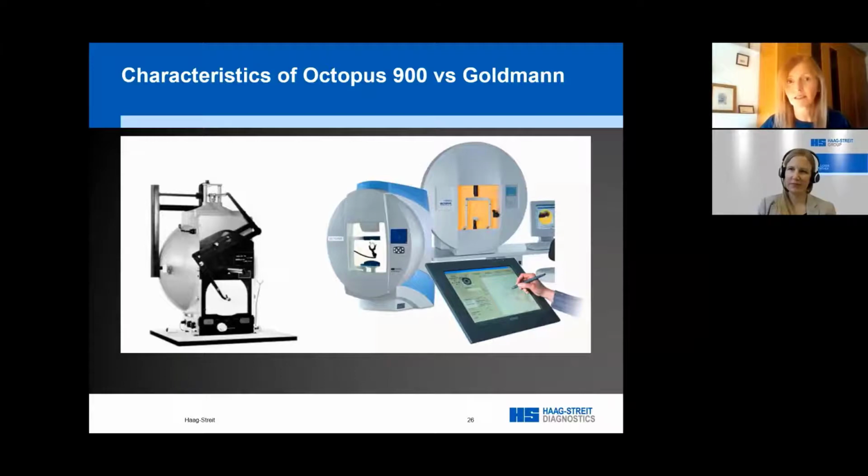Octopus Kinetic will join the dots for you. And initially when you join the dots, they're straight lines, but you can select the spline function, and that then gives you the curved line. Still doesn't look quite the same as the Goldman, but crucially, there's no examiner bias here. The computer is simply outlining the actual patient results. And actually, if you don't like it, don't join the dots, but print it out and join them yourself. It's still the same thing.